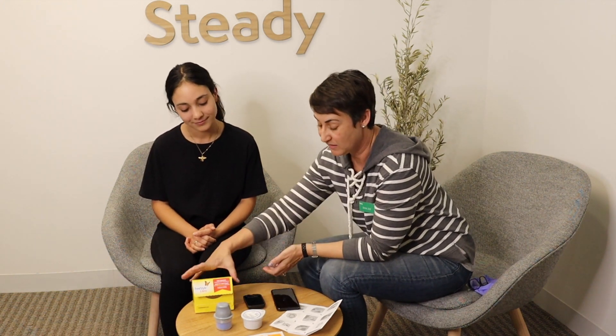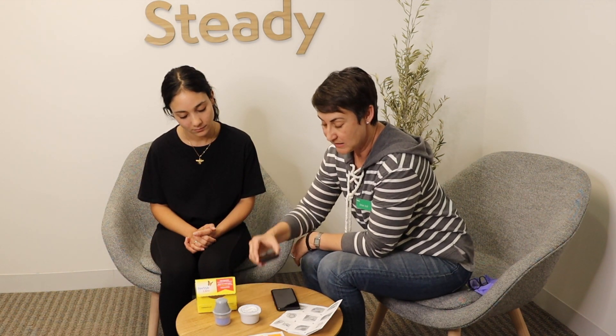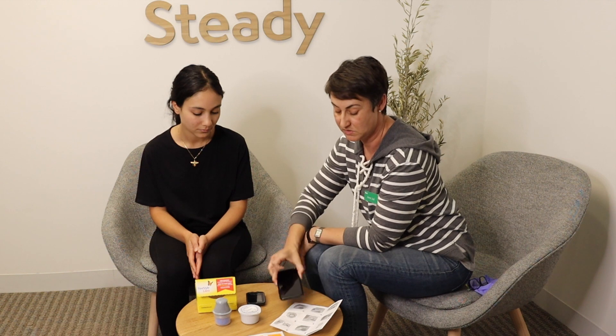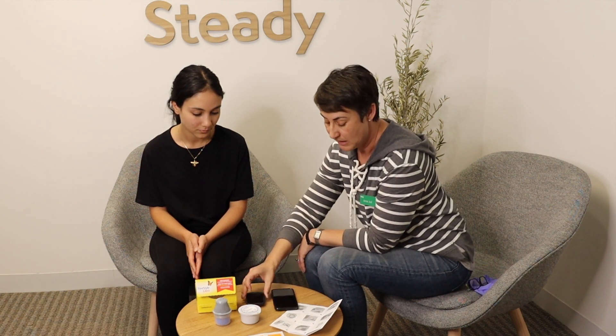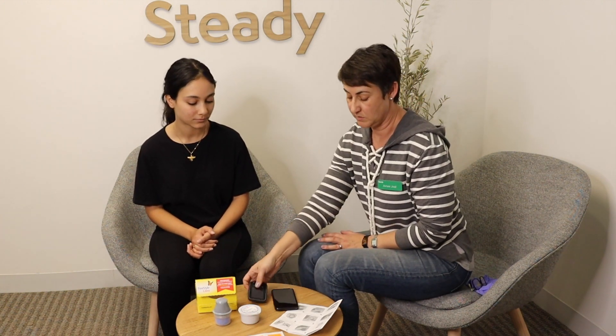The Freestyle Libre Continuous Glucose Monitor comes in a box like this with a single-use applicator and sensor. When you obtain the system, you will also get a receiver to use, but you can also use an app that you can download on your phone as the receiver — you do not have to use the physical receiver. The biggest difference from other CGM systems is that you have to physically activate the receiver to read your blood sugar value. You either use the receiver or your phone, physically scanning it over the sensor, and the result will show up on the receiver or your phone.